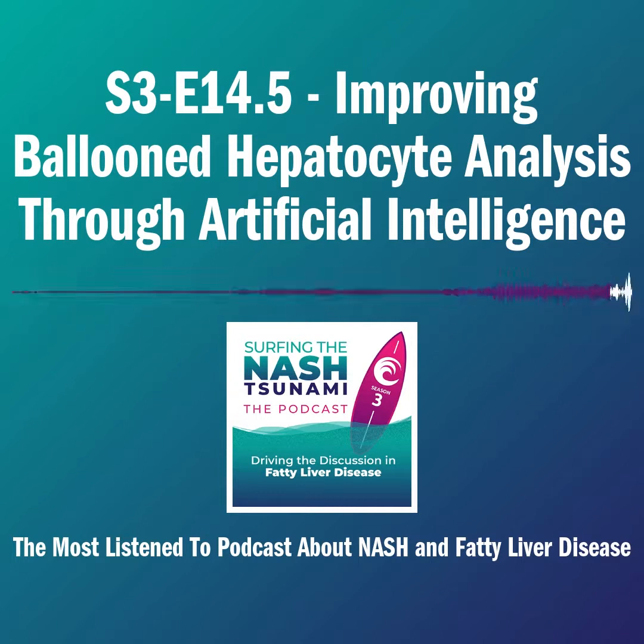You have different septa. One is indicating progressing, one is indicating regressing. We see it all the time. I think everyone sees it, and they are convinced that's what's happening. AI can really come in and help to address all these subtle changes in a fully quantitative, fully reproducible manner. And this really is a powerful tool for drug development.